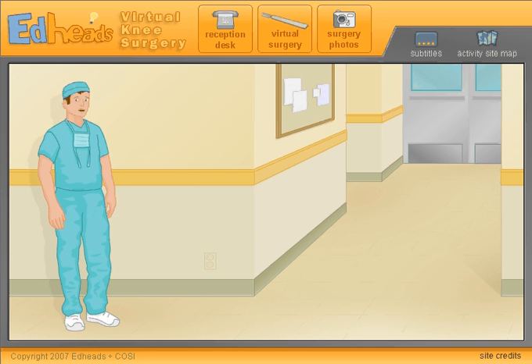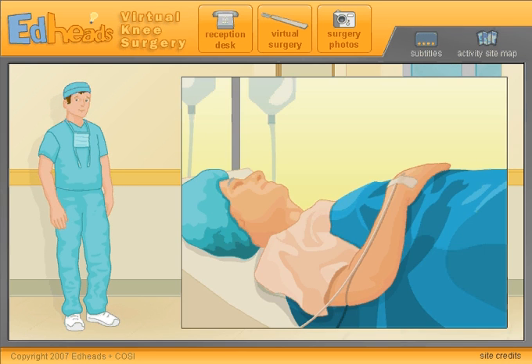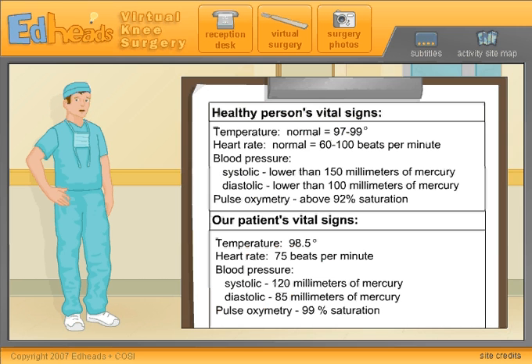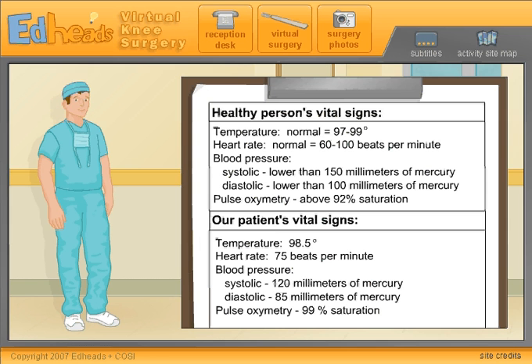Today, our patient is a 76-year-old man. It is mandatory to check the patient's vital signs before beginning surgery. An anesthesiologist in the operating room performs this step.